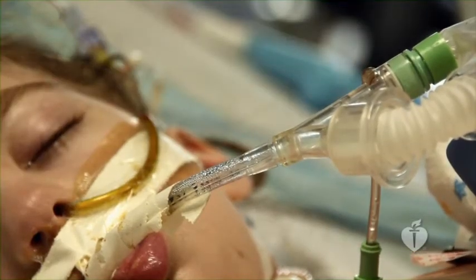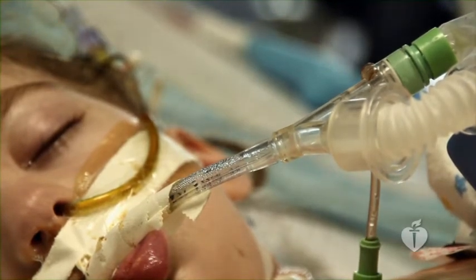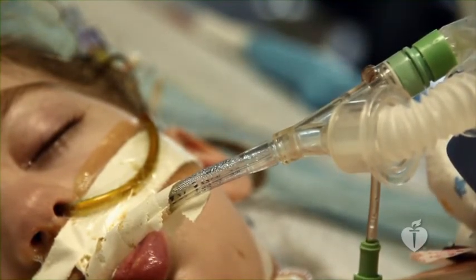During cardiac arrest, pulmonary blood flow is very low, so exhaled CO2 may not be detectable despite correct endotracheal tube placement. If there is still uncertainty about correct endotracheal tube placement, perform direct laryngoscopy to visualize the tube between the vocal cords. Although useful, the presence of water vapor in the tube, symmetrical chest movement, and audible breath sounds may not be 100% reliable indicators of proper tube position.